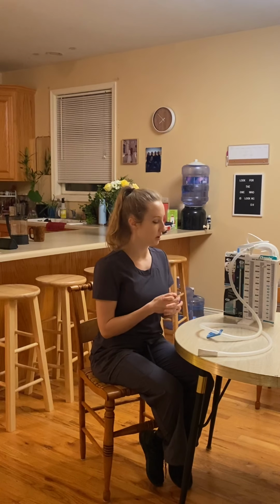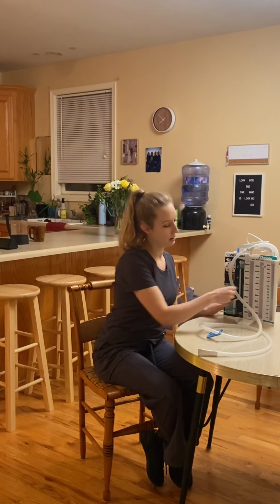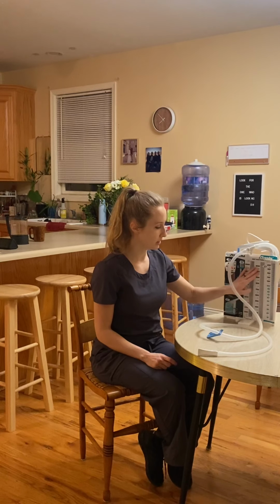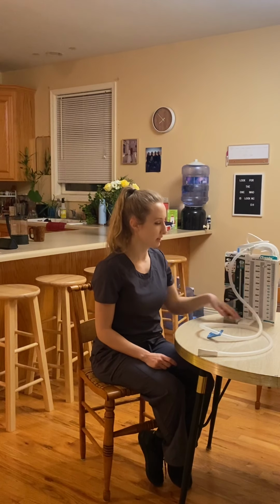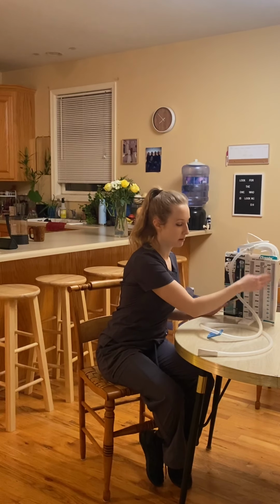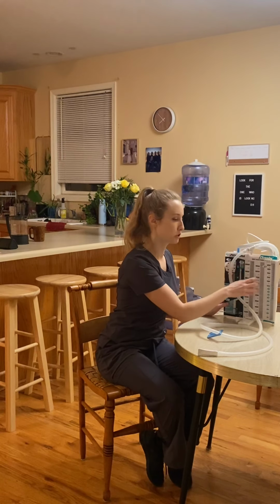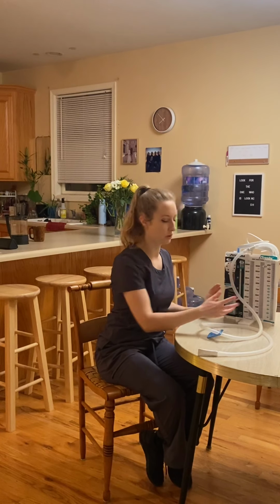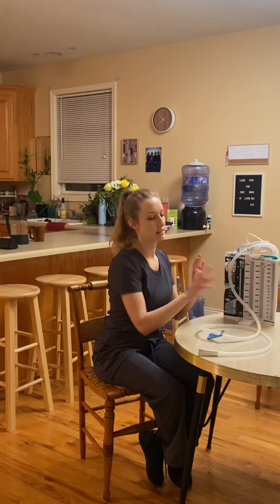So you're going to notice us writing on your chest tube a lot, and that is because this column right here is a collection chamber. We do measure the amount of drainage that we get, and we do mark and initial it. We never actually empty this. When this is full, we will just throw this away. That would be a 2-person job, and you'll notice that we do clamp that in between changing it.